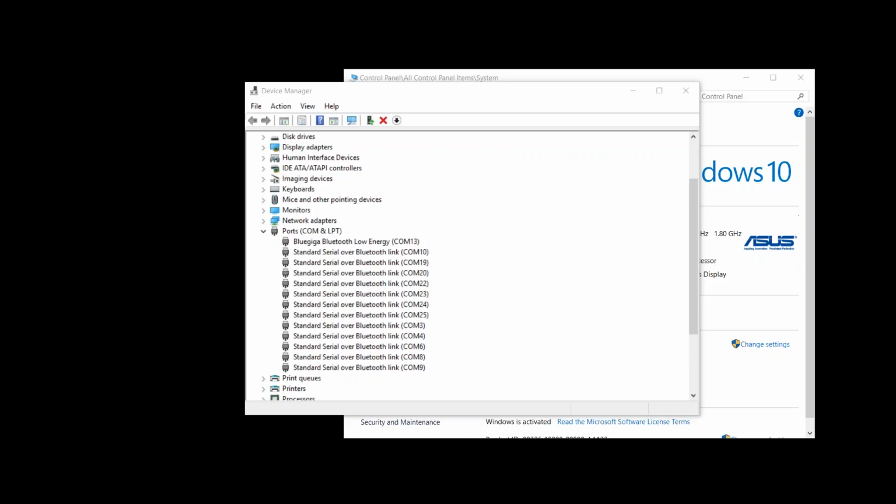What is the time storage on the M-Cell? M-Cell Smart is a lot. I think it was nearly 100 hours. If you have older M-Cell Classic, then those M-Cells can only store for about 7 hours or so.